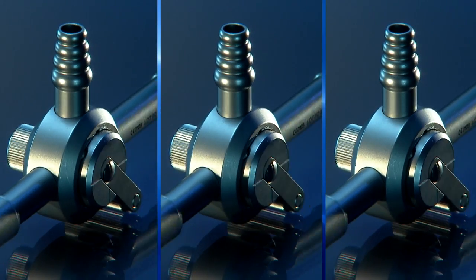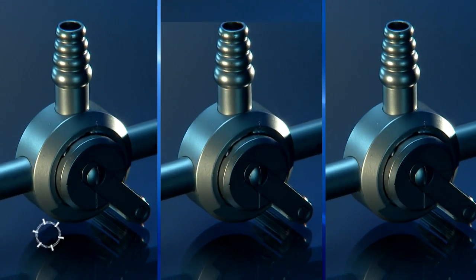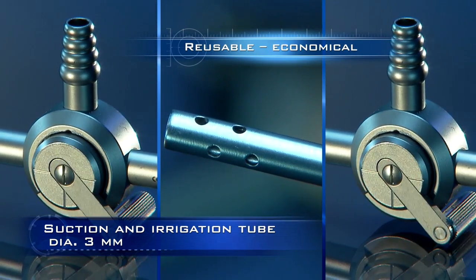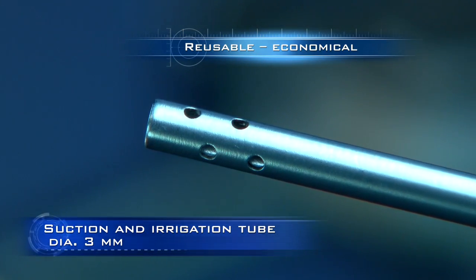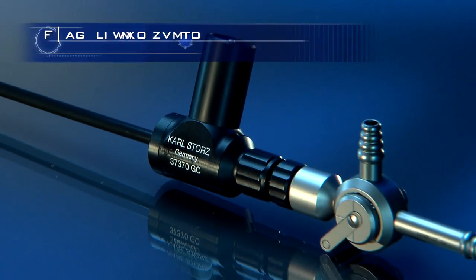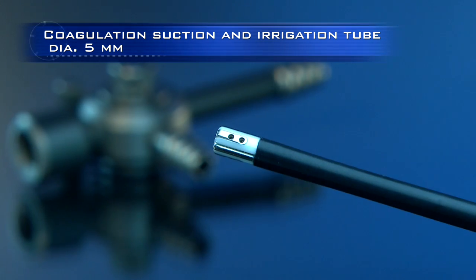All the instruments in the mini-laparoscopy set are of course reusable, including this 3mm suction and irrigation tube. This instrument combines the function of a suction and irrigation tube with simultaneous coagulation.